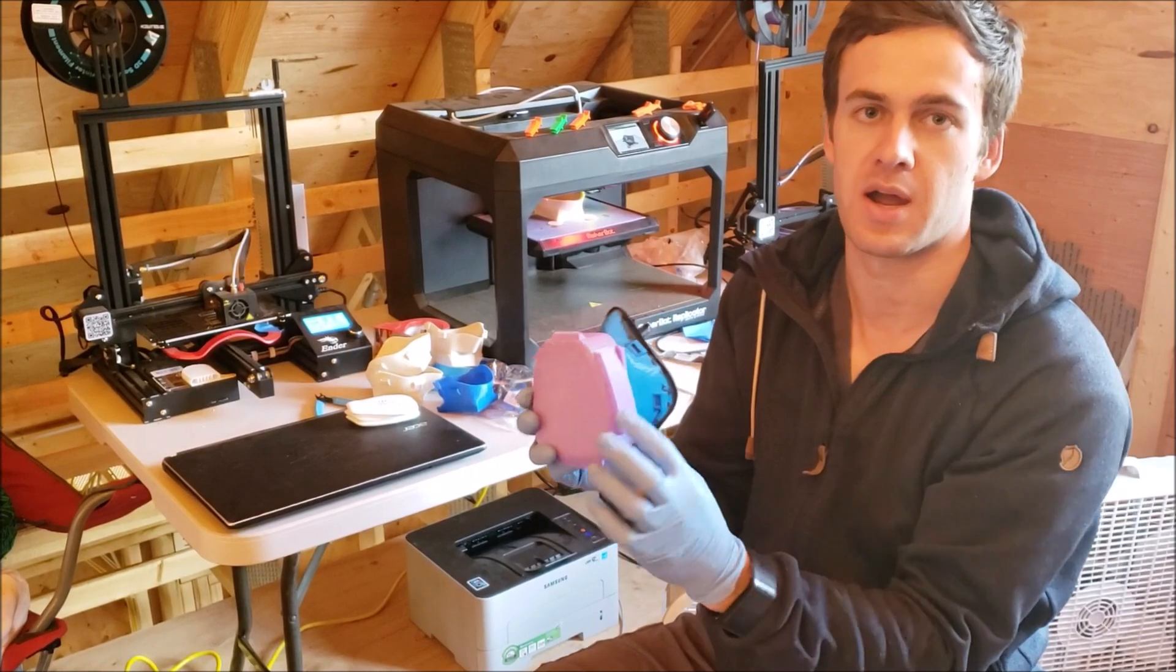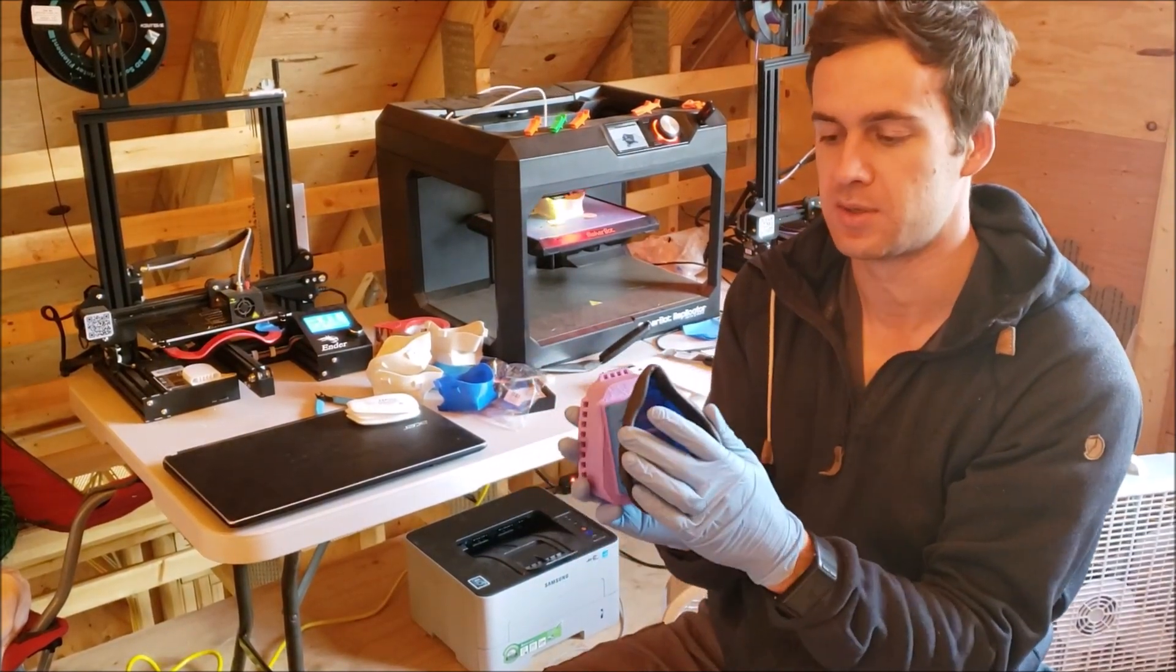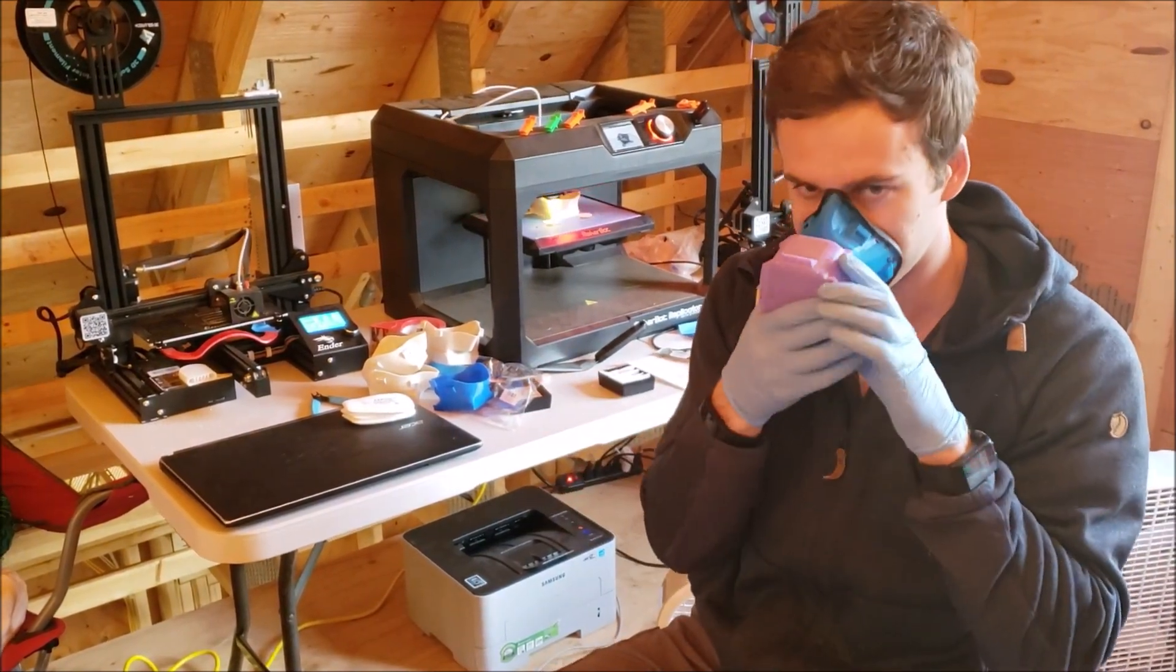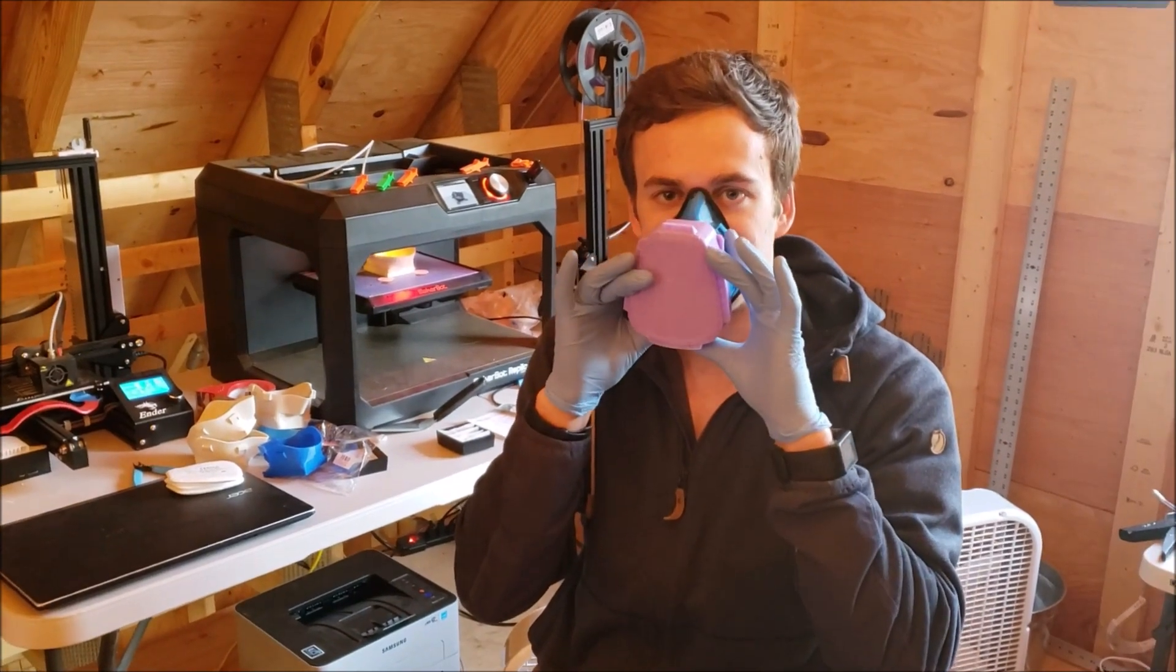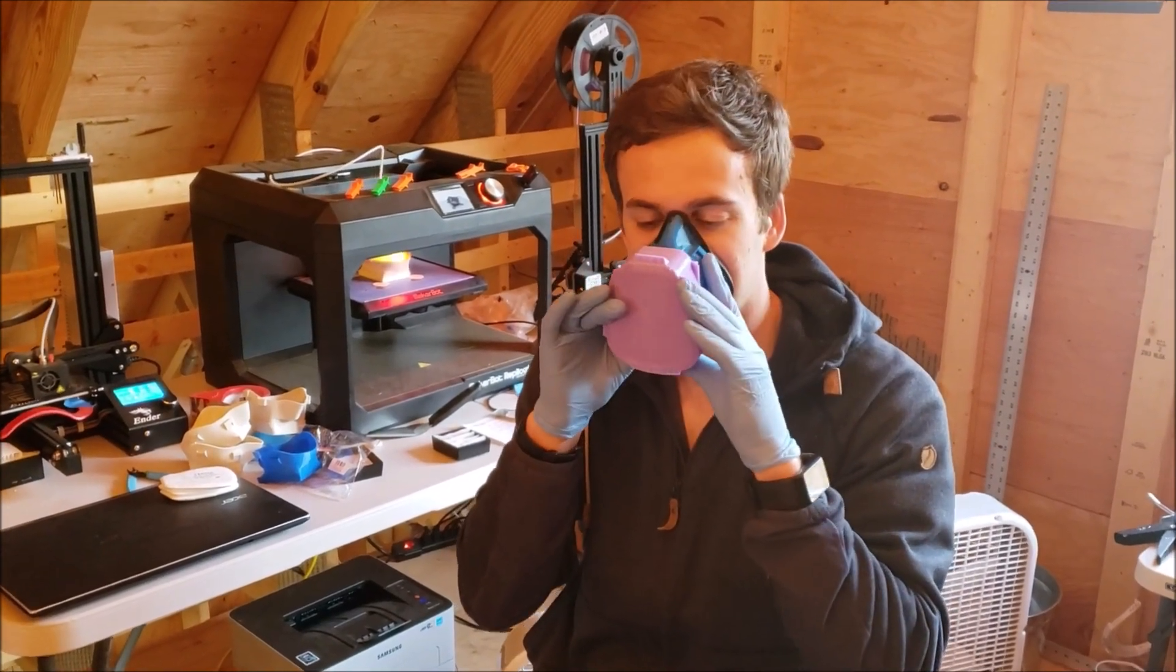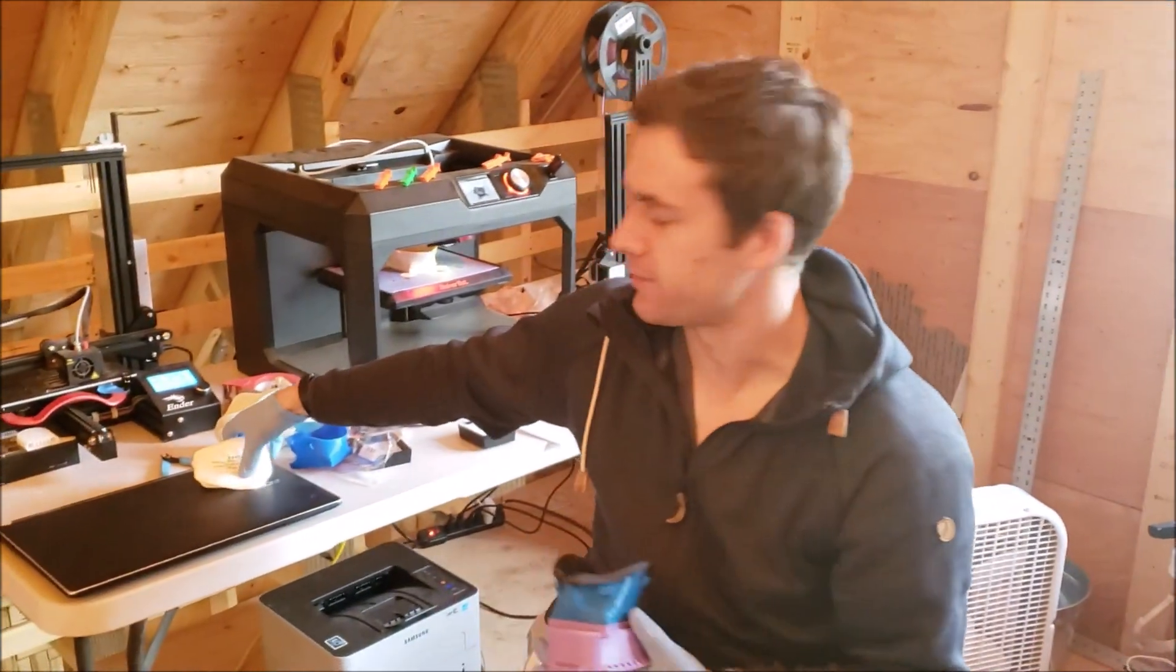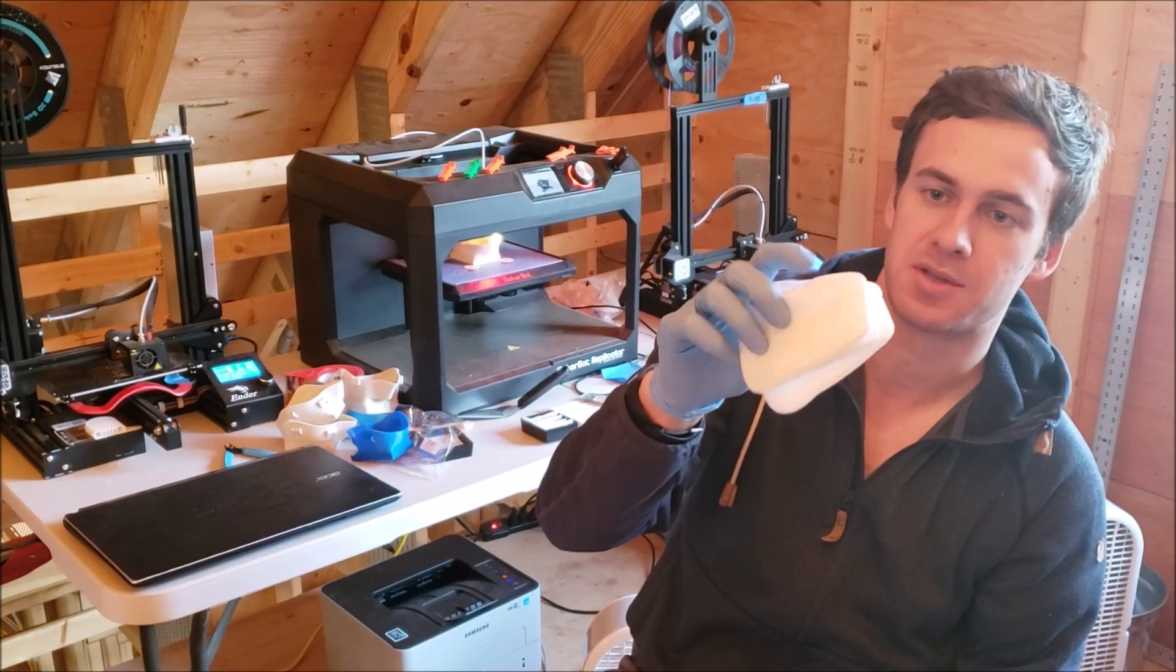You should silicone or hot glue everything together to make a good seal, and then you strap this to your face. And now you've got a way to breathe through these filters with our 3D printed mask.